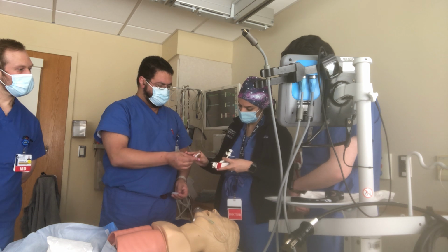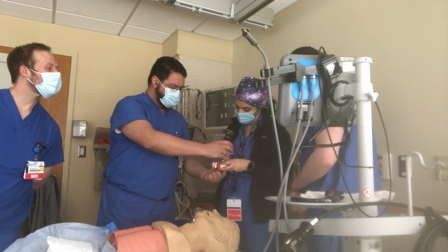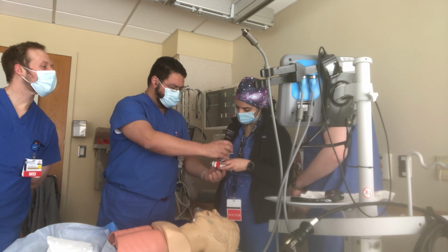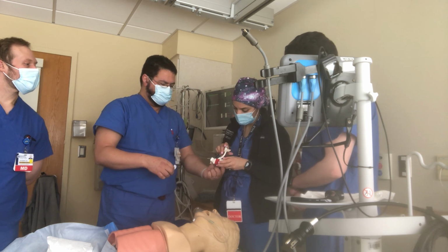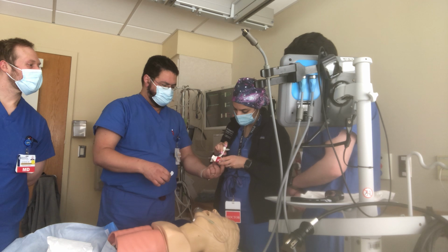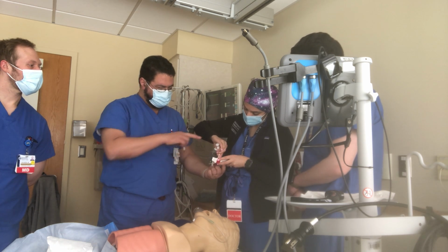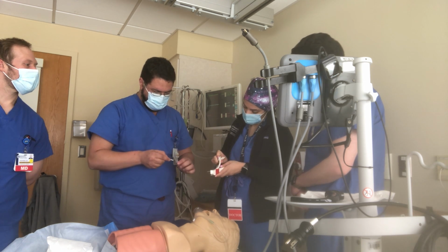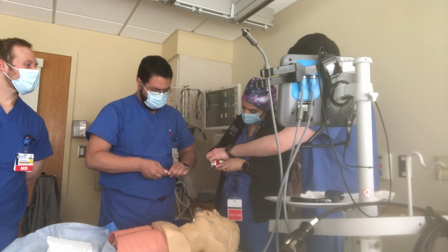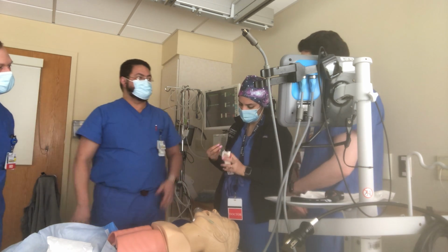You make a cut and advance the whole thing. Right? So we cut here. Yeah, just like that. As if you're doing a central line. Yeah, deep, more. Good. And now advance this. Yeah. It's gonna feel difficult. So you're gonna have to really put your finger on the obturator, and push hard. Yes. Keep going. Yes, that's it. And then you remove the obturator and you're done.